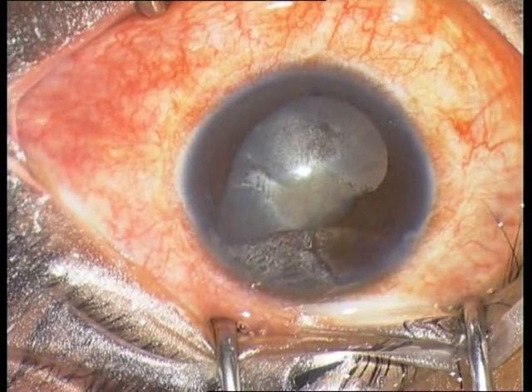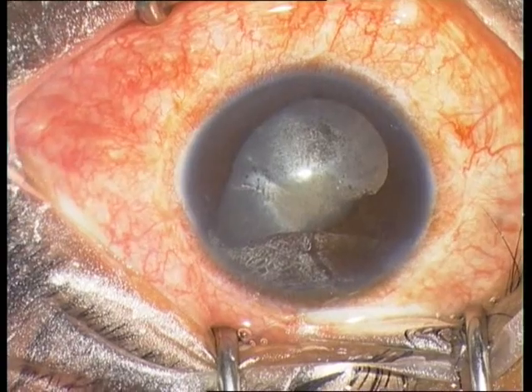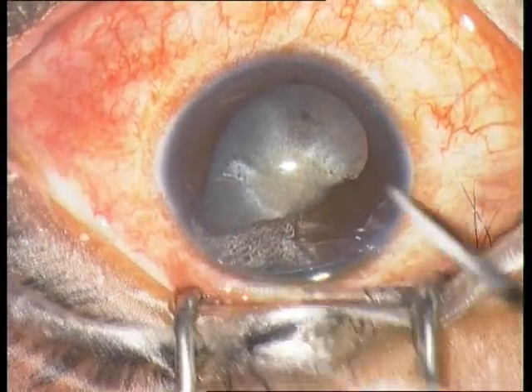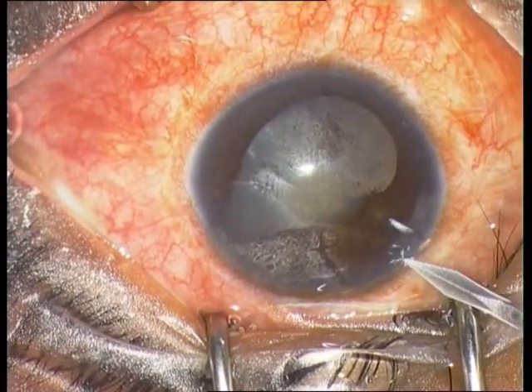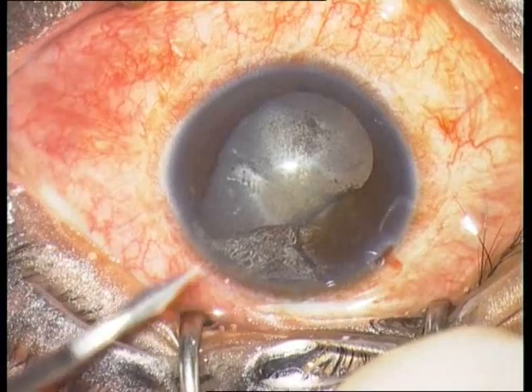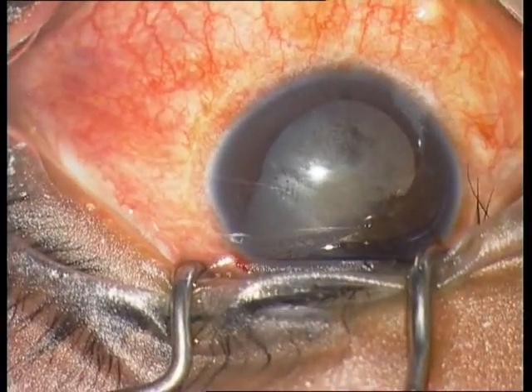This 27-year-old male patient suffered a paintball trauma to his left eye. The eye developed hematocornea and traumatic cataract, and was treated conservatively with IOP-reducing medication for 8 months.